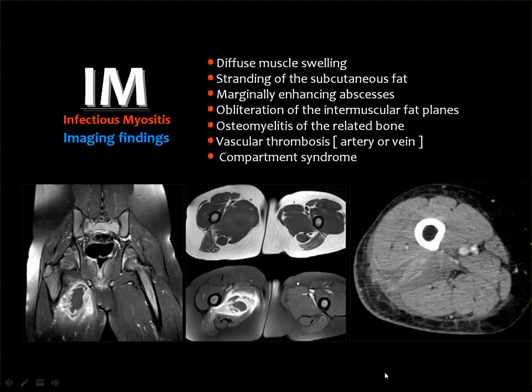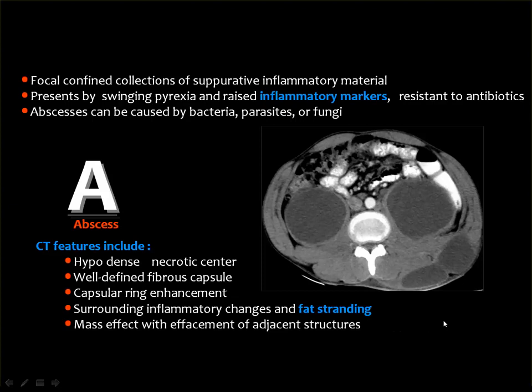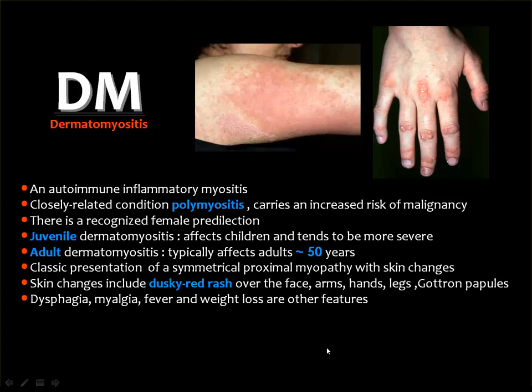In infectious myositis in a diabetic patient, inflammation of the vastus lateralis and adductor magnus muscles is not clearly seen in T1 but is well appreciated in STIR, and after contrast injection. Key findings: well-formed marginally enhancing abscesses (not present in early cases), and assessment of bone integrity. General imaging findings include diffuse muscle swelling, stranding of subcutaneous fat, marginally enhancing abscesses, obliteration of intermuscular fat planes, and if spread to bone, osteomyelitis; if affecting vessels, vascular thrombosis; if in the leg, compartment syndrome.